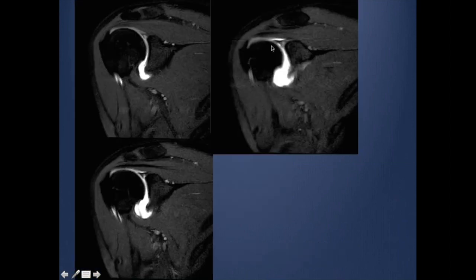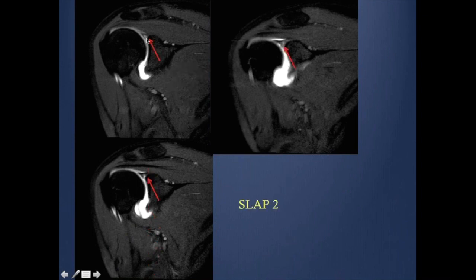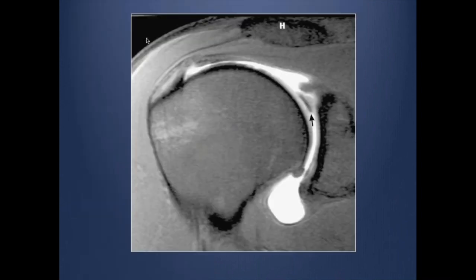If you look here carefully, you have abnormal signal here, so this is more of a SLAP Type 2. This next case has a separate fragment, so this is SLAP Type 3.